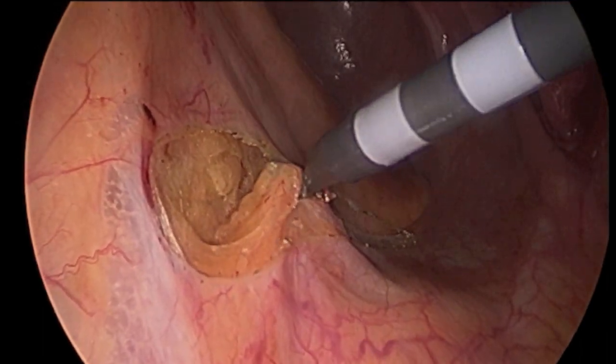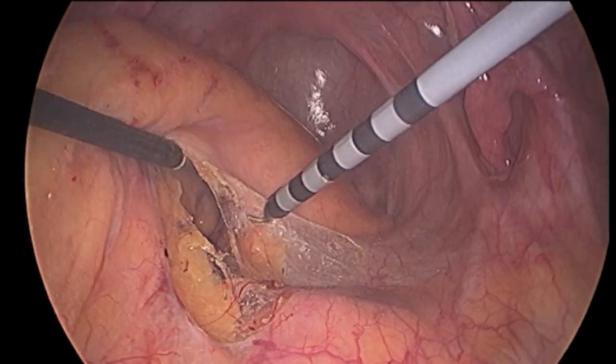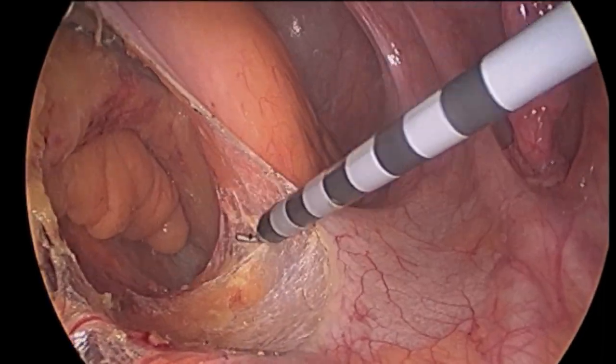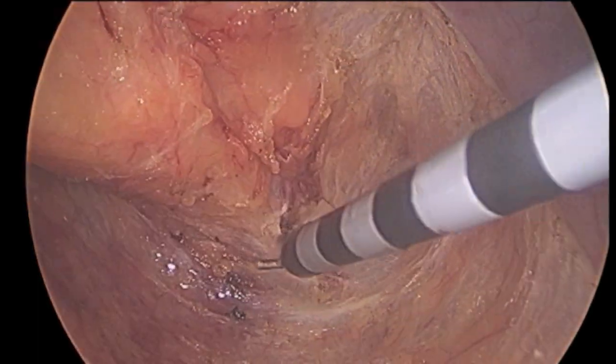The nerve, having been identified and preserved, allows the mobilization of the rectum to proceed safely. The initial dissection is done with an electrosurgical device, as the risk of bleeding is low and there are few blood vessels in this tissue plane.